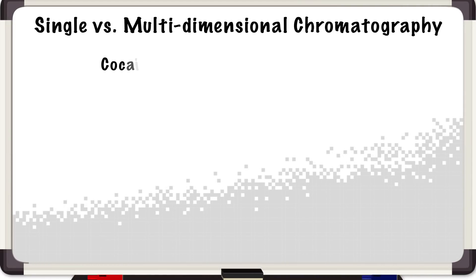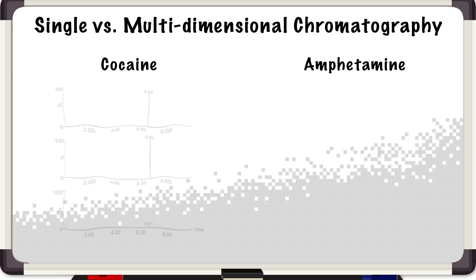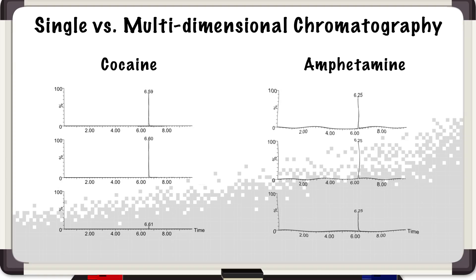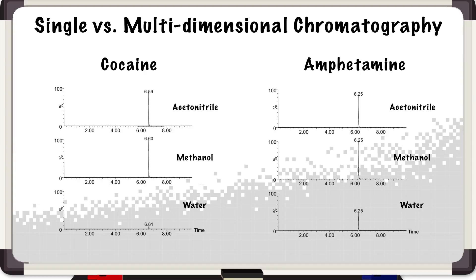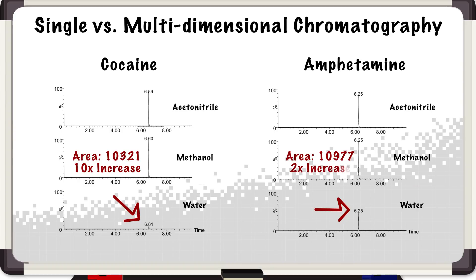In the world of single-dimension chromatography, we have a scenario where we can only inject a strictly aqueous extract, but in 2D mode, we can inject not only aqueous-based but also organic-based material. On the bottom chromatogram, you can see we have two metabolites — cocaine and amphetamines. We see a very low signal due to exchange scenarios on the glass vial. But when we convert to an organic extract from SPE material, we were surprised to see at least a 10x or 2x increase in sensitivity. That's the power of the multidimensional chromatography concept.